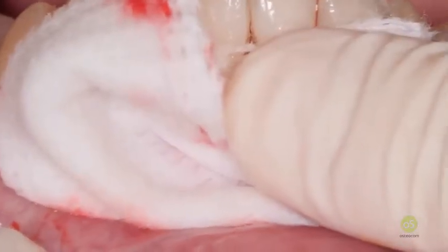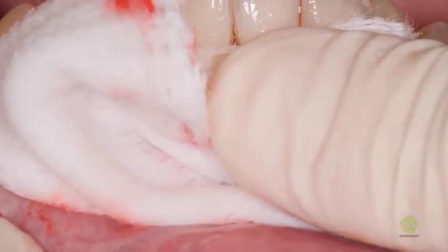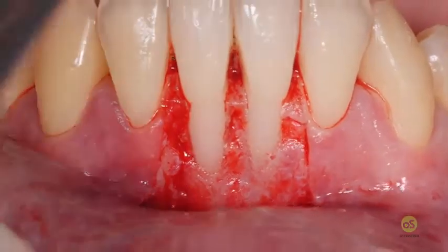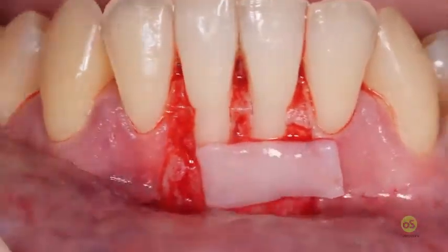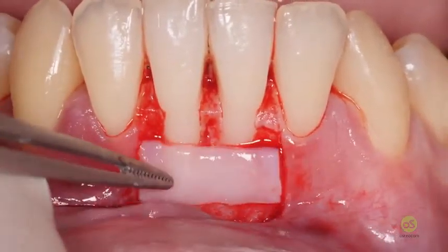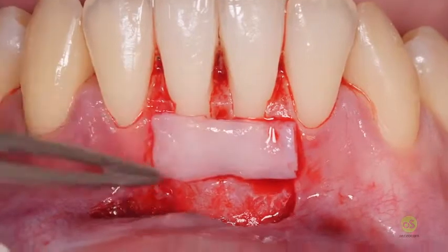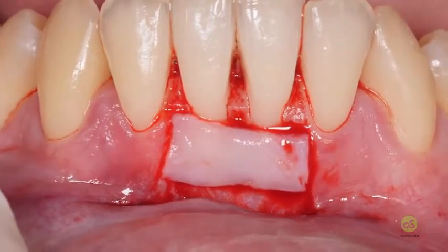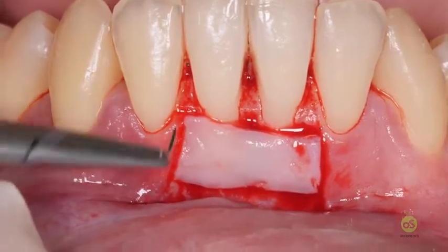Now we take the same suture material we have used before, the 7 millimeter long needle. And you see that the apical corner dimension of the graft is equal to the vestibulum depth.